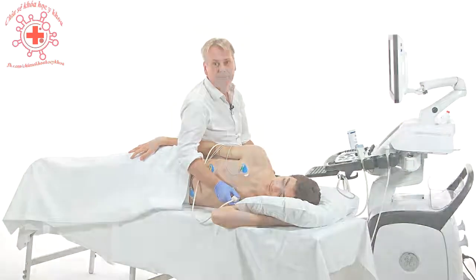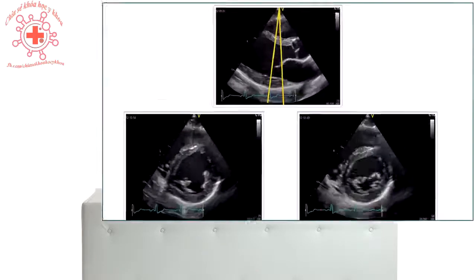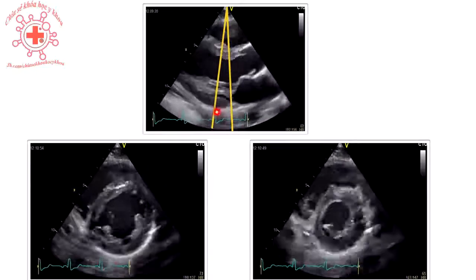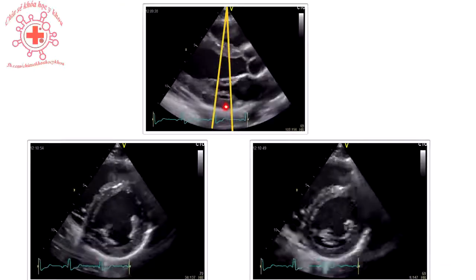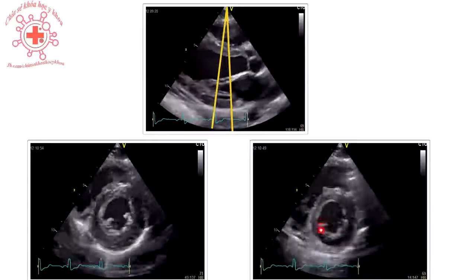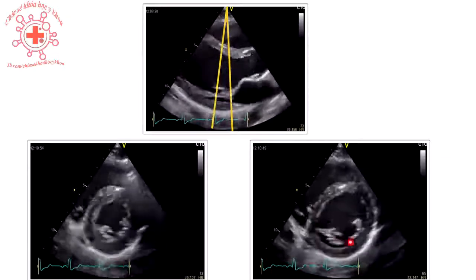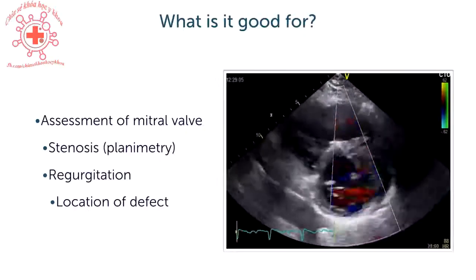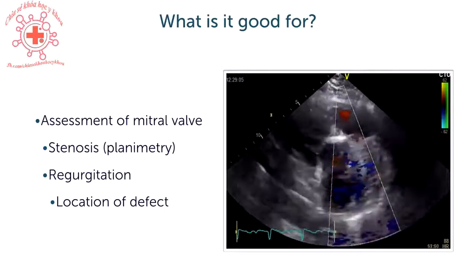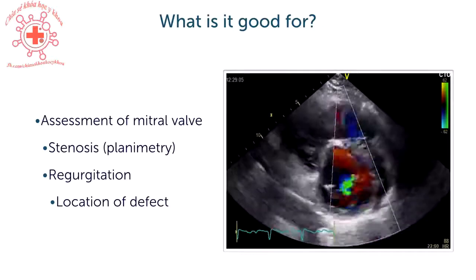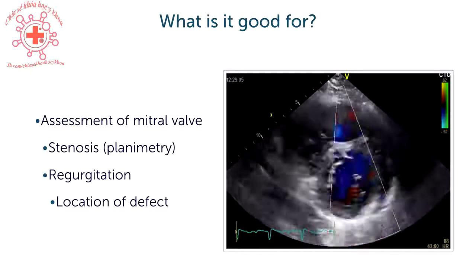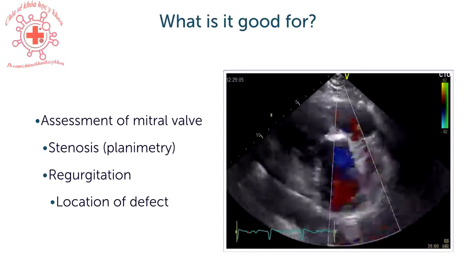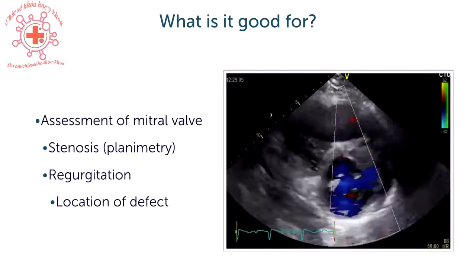This is a very important view if you want to exactly localize a mitral valve pathology. If you want to image the mitral valve in an optimal position, it's very important that you transect the mitral valve at its tips. If you're too far caudal, you will only image the subvalvular apparatus, so you need to scan back and forth to find the optimal position where you really see the fish mouth. This view is used to look at the mitral valve, tumors, degree of calcification, and mitral annular calcification, but it is especially important for quantifying the severity of mitral stenosis by performing planimetry. You can also assess the origin of mitral regurgitation.